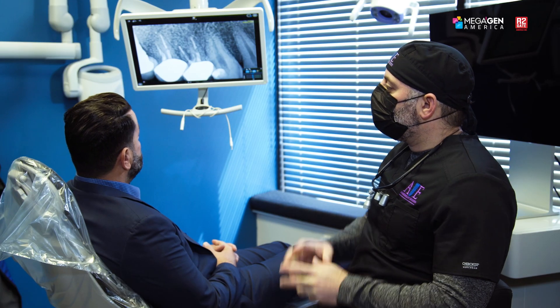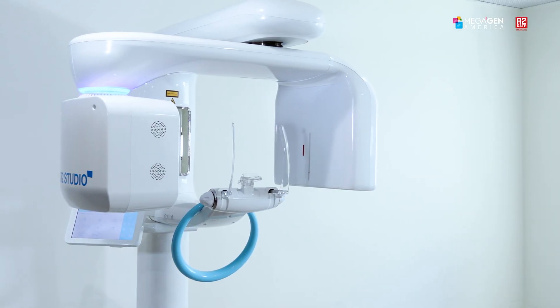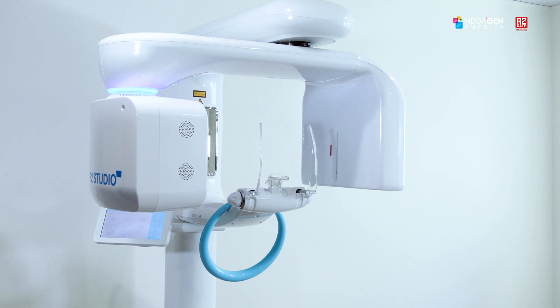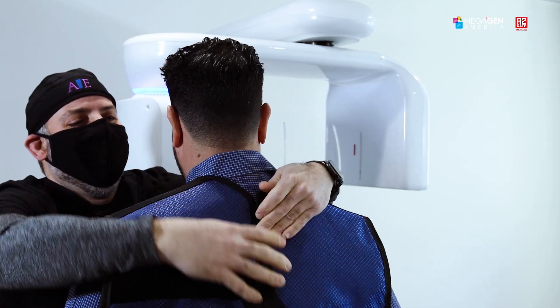What I'd like to do next is take a 3D scan and evaluate this more closely. Basically, we're going to have you stand in the machine and it's going to spin around your head — capturing all the data: the tooth, the bone, the root canal, the crown — giving us all our potential options to fix this situation. Over the years, using CT machines, making them smaller and developing them, we came out with cone beam technology that can be used in the office. Having this at our fingertips is paramount to success, to be able to plan our patients before we ever do any type of treatment.